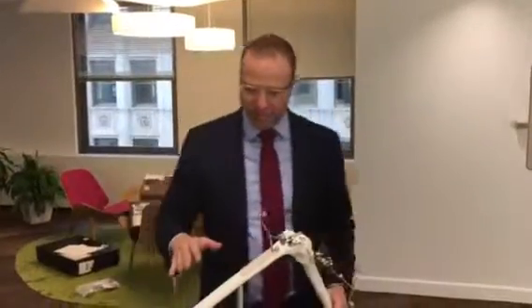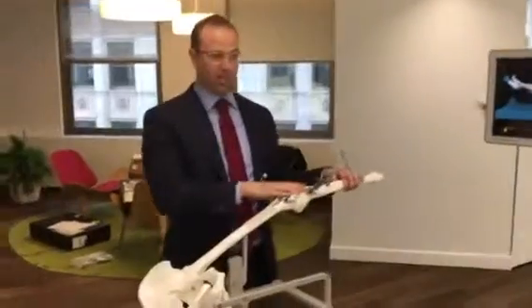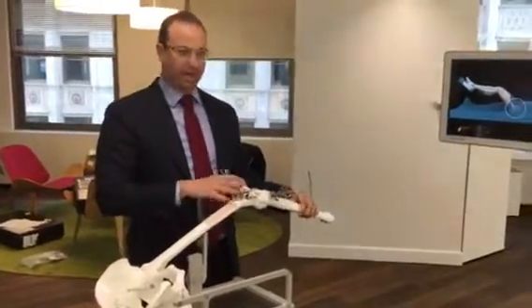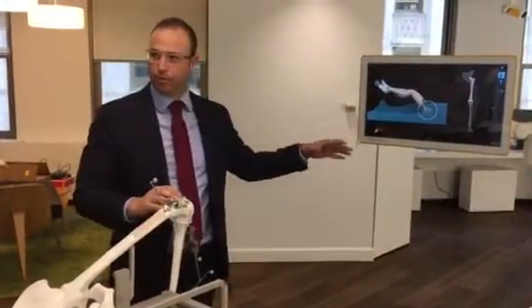Alright, so we're going to demo KNEE3. We're going to walk through the entire registration. As we know, KNEE3 is imageless, so no CT data ahead of time, no MRI data, no x-rays required. We're going to build the three-dimensional model inside the computer.